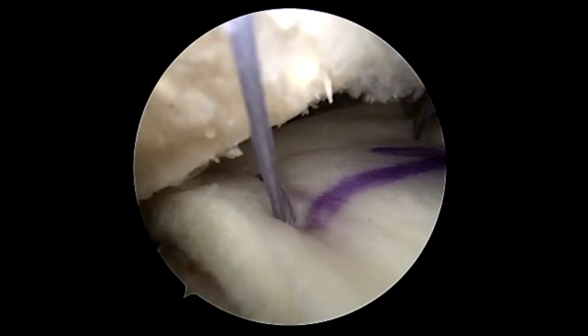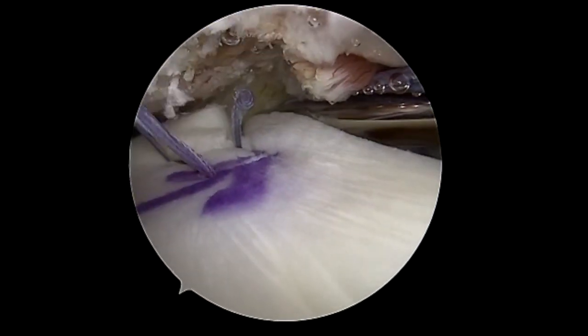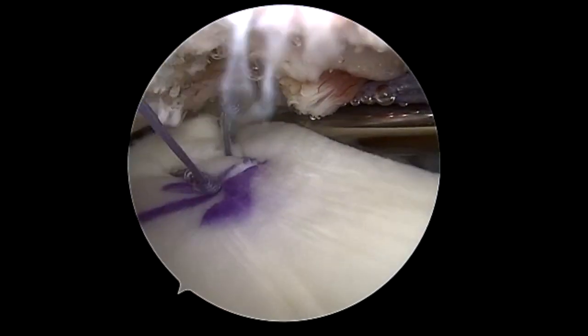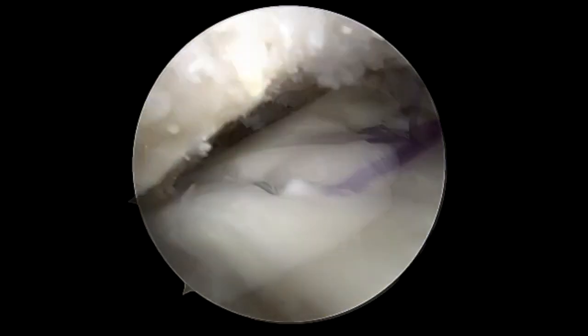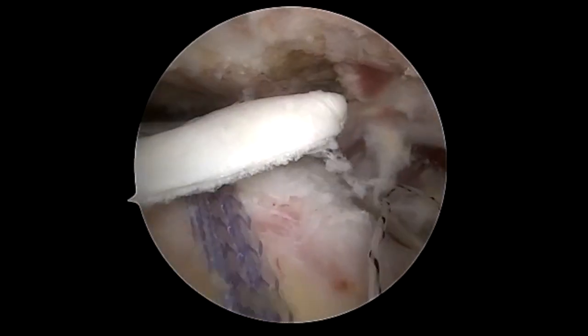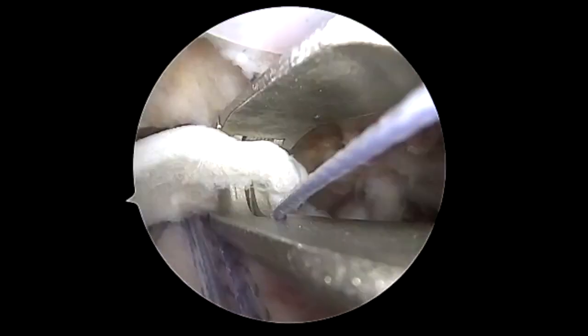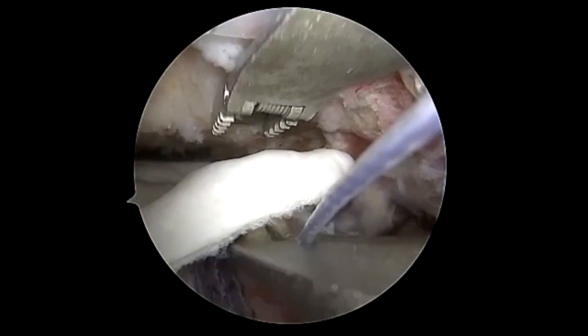You're going to tension — you can see excellent pullout strength — and then we want to place a third stitch to tension this down. Now we're going to work our way towards the lateral row. You do not need to have a separate suture attached to this; we had all simples and then we attach them, and now you can see the patch floating and it's quite easy to fix this down.